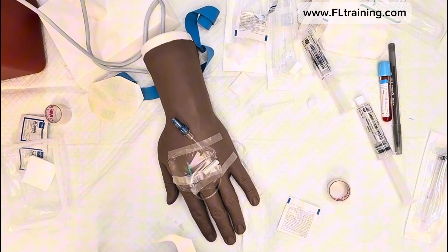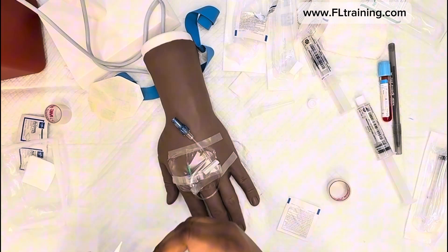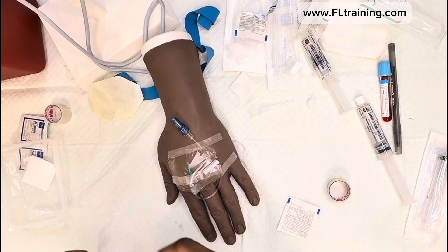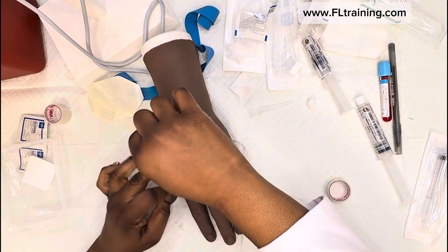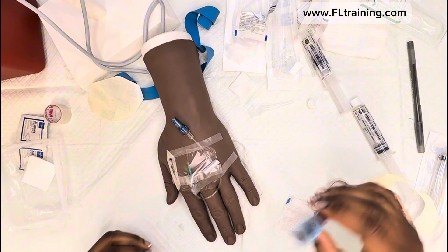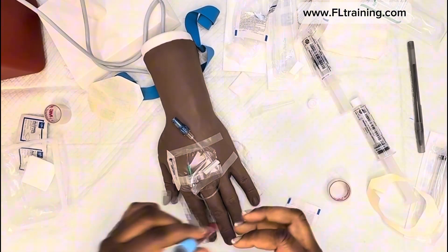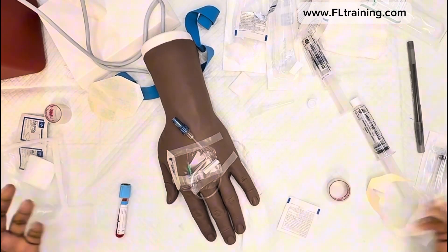In our simulated environment, things happen and we just keep going. I'm going to peel a portion of the label that comes with the IV start kit and place it on the line. Remember, we don't write on our patients. Don't forget to label your tube, sign, date, initial, and insert it inside the specimen collection bag to send to the lab.